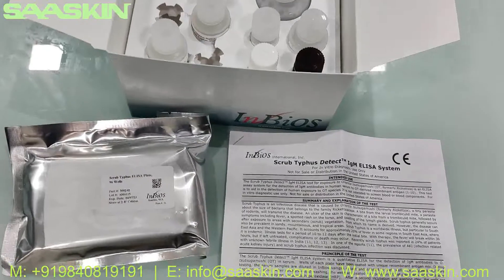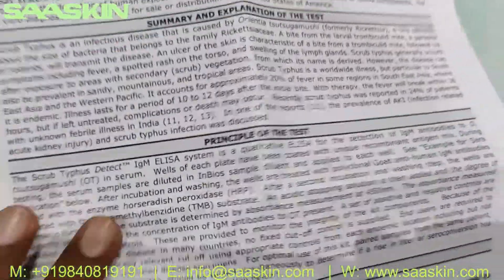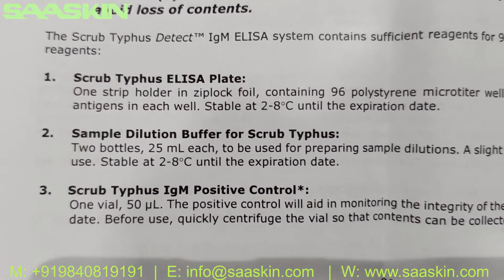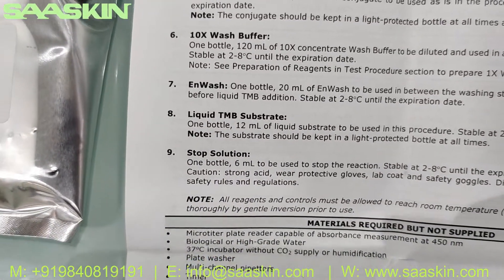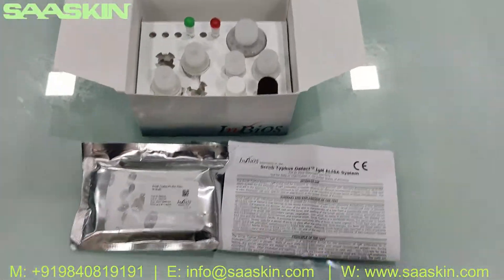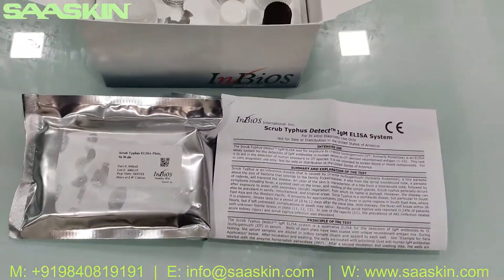Those are the complete contents. Each box contains the different solutions, a 96-well plate, and an IFU brochure. To summarize: you get the Scrub Typhus ELISA plate, sample dilution buffer, IgM positive and negative controls, ready-to-use enzyme conjugate HRP, 10x wash buffer, IN wash, liquid TMB substrate, and stop solution. This is the complete INBIOS Scrub Typhus Detect IgM ELISA test kit.